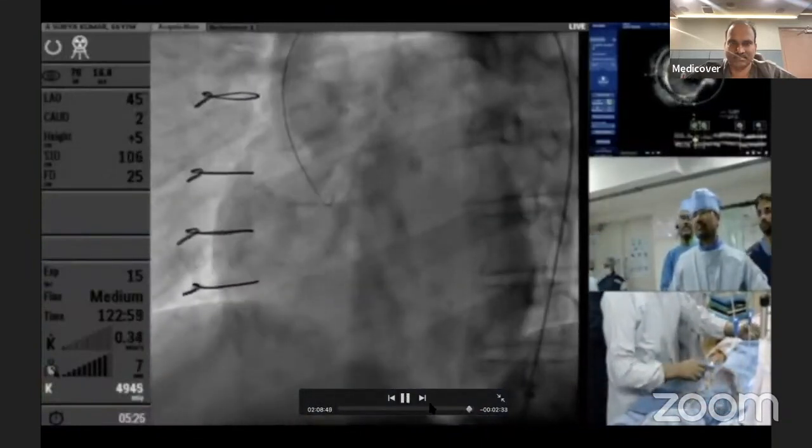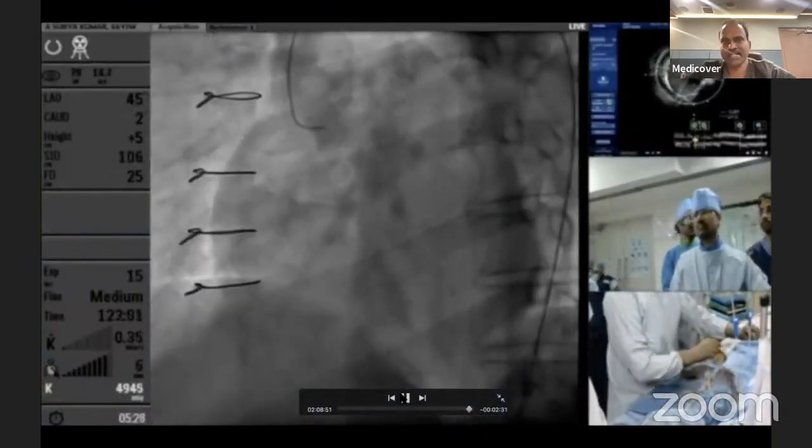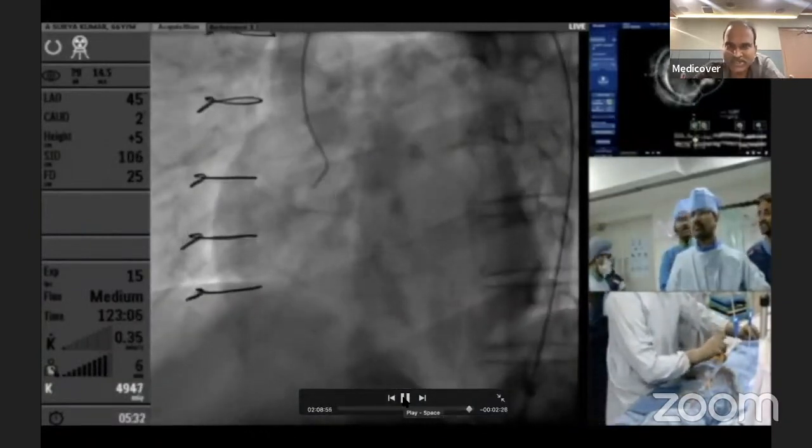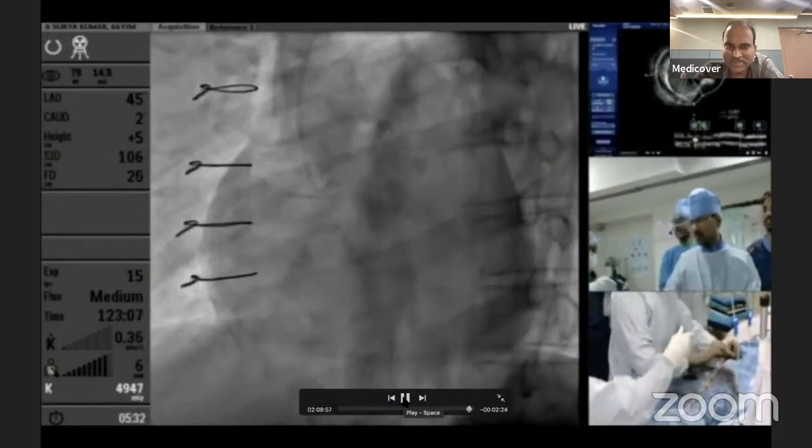Anyway, we open left now. I think generally I always give a small injection, but never a forcible injection into right. You can see that's why I'm taking a 5 French catheter. Managing time. Just to understand, your subintimal space is open. Let us see what happens.